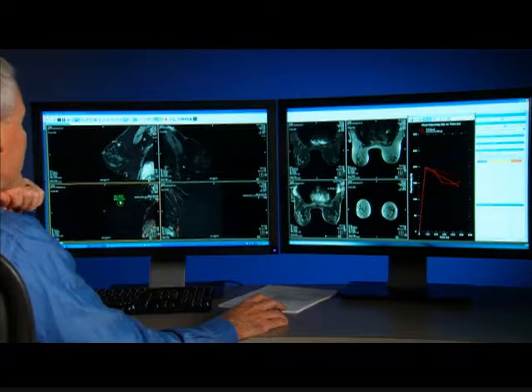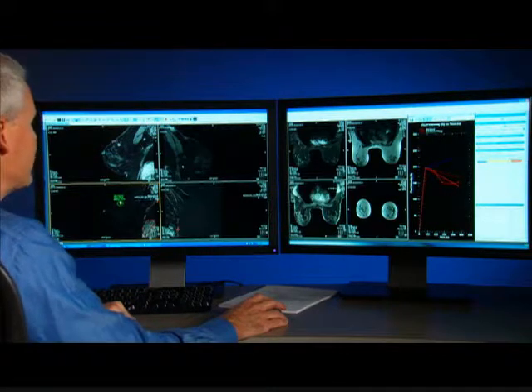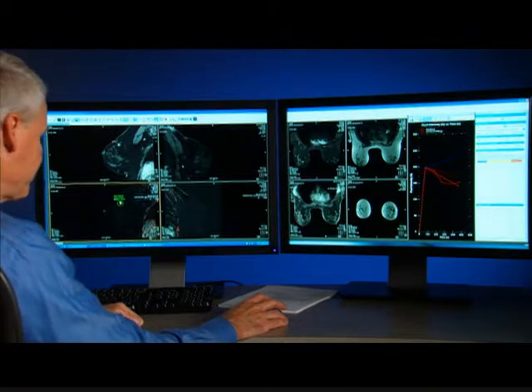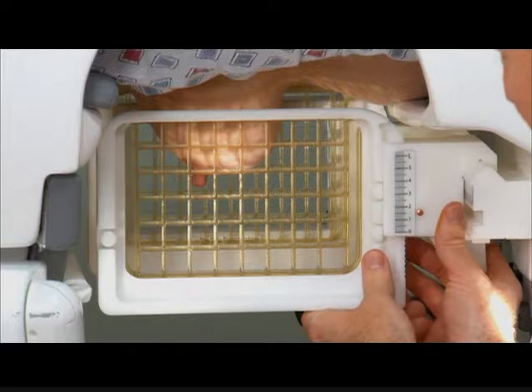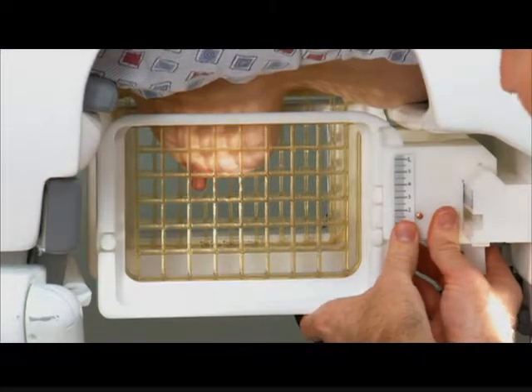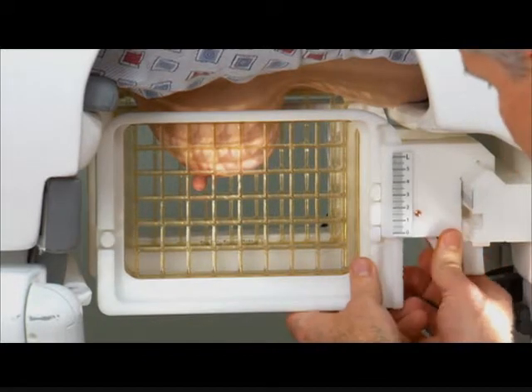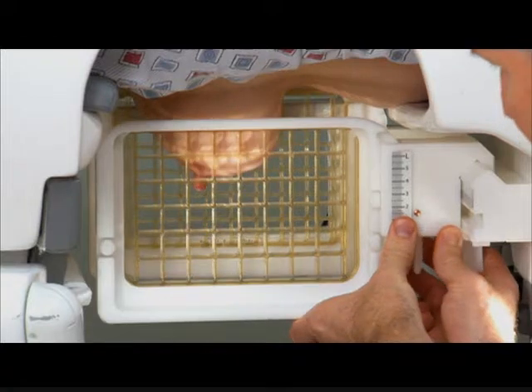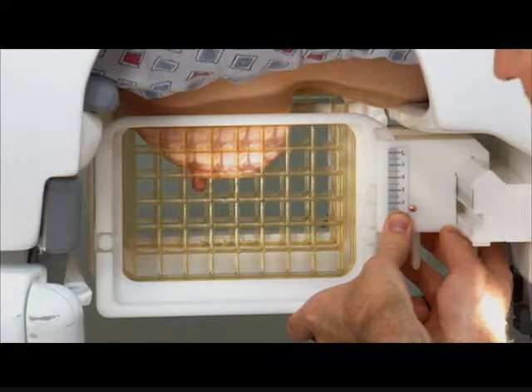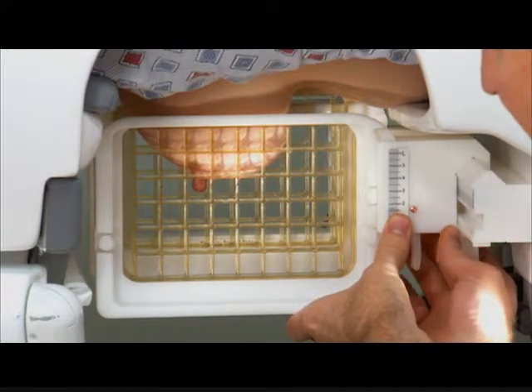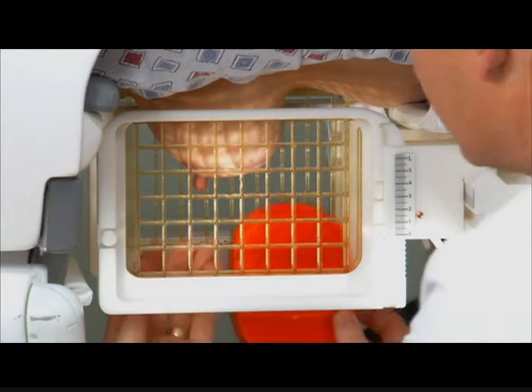What I would do in this case is follow this to biopsy and demonstrate our approach to biopsy. One of the initially very important things in performing breast MRI biopsy is to position the patient correctly. My personal bias is this is not something that technologists should do. In our institution, technologists get the patient in place on the table, but I always position the grids as well as the breast tissue. You're the one who knows best where the lesion is and the issues at hand for getting appropriate compression to facilitate your biopsy.